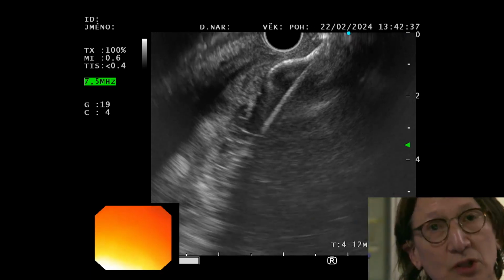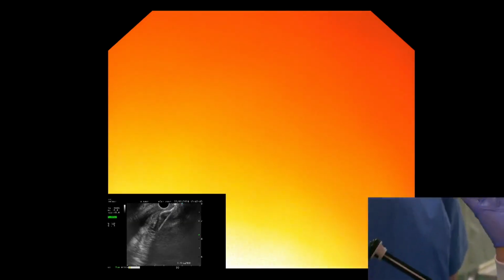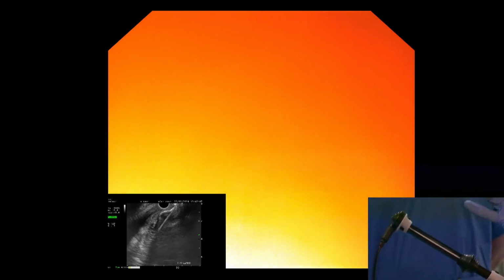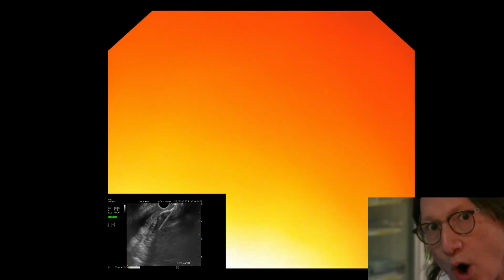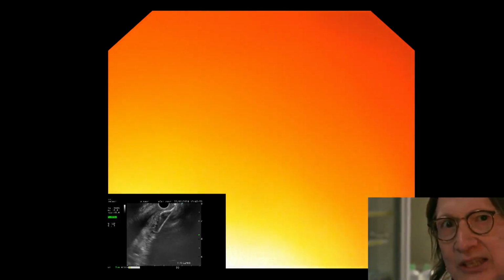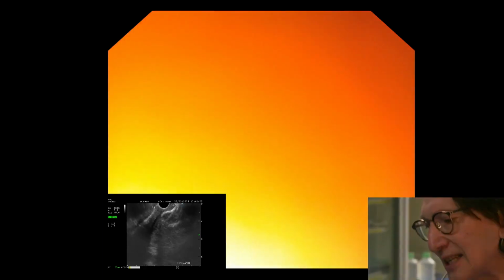Now I'm going to switch to the endoscopic view. And let's have the endoscopic large. And I am going to now push the proximal flange out of the working channel. But as I'm doing that, I'm backing off from the wall and I'm insufflating gas. And it's a slight turn to the right. My body turns to the right. And I'm giving some gas.